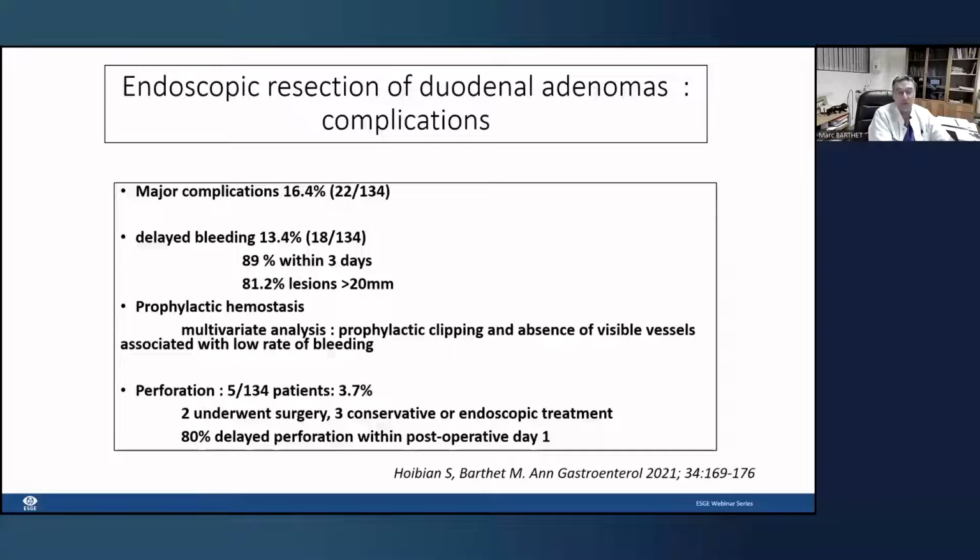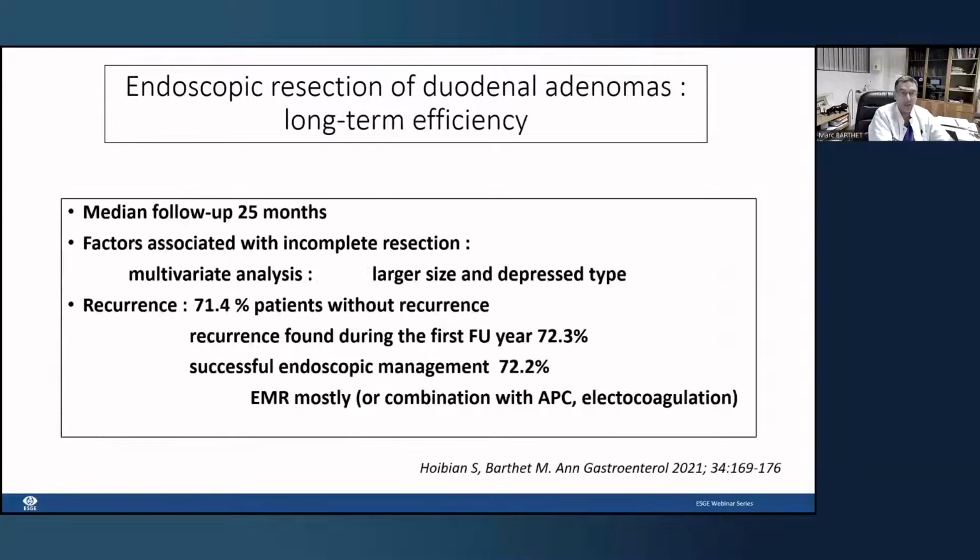And one of the most dangerous devices to use after endoscopic resection is APC. APC increases a lot the risk of delayed perforation. So avoid APC after endoscopic resection. So take care, because you can also have a delayed perforation.